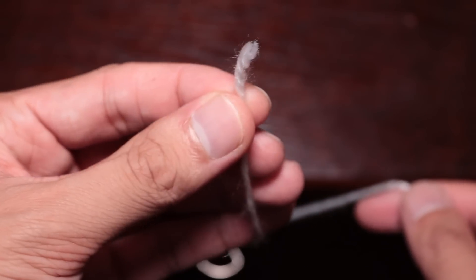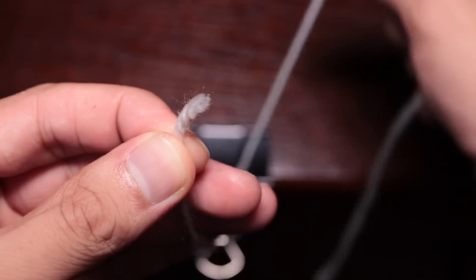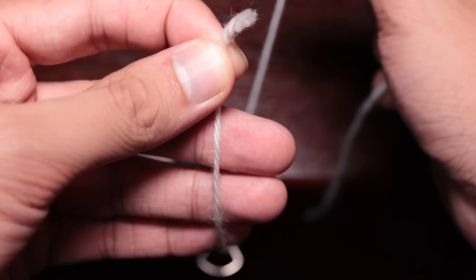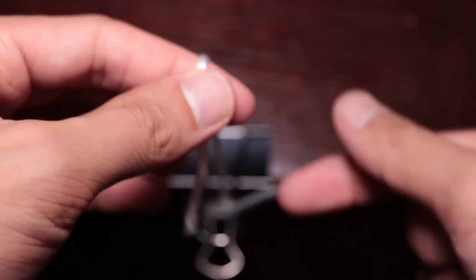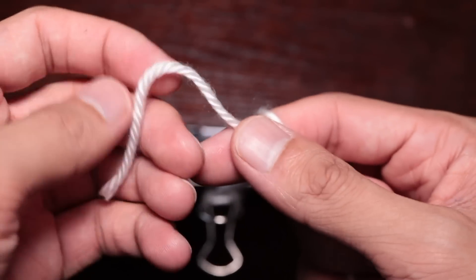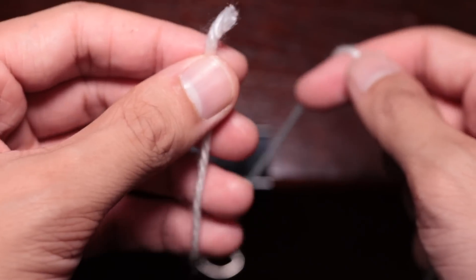The second style of knot is with the middle fingers or with the rest of the fingers. Sometimes the grip is going to be taut like this when you're holding it the same way, but then you're putting your middle fingers under everything and it's kind of confusing because the string is going up and down. It's way easier to just do it intuitively and hold the string upside down like this as you're starting from the suture from towards you.